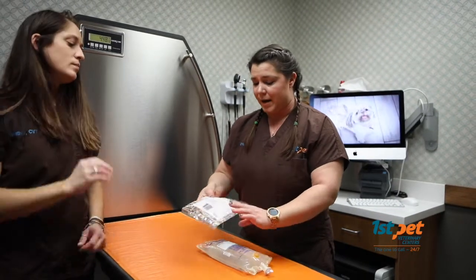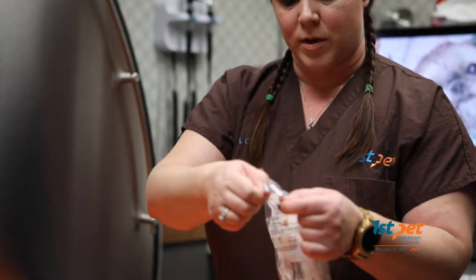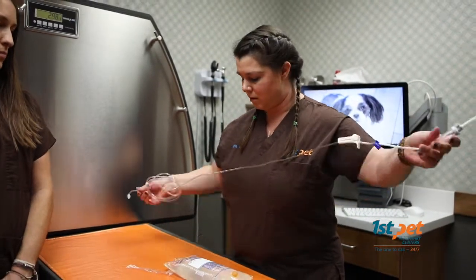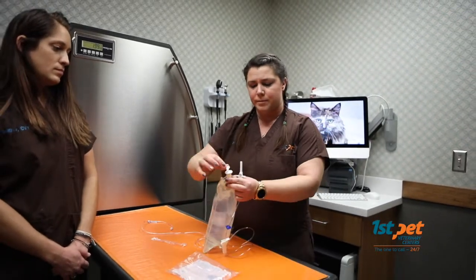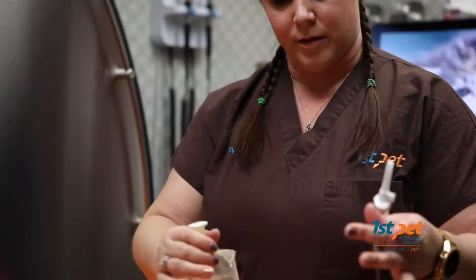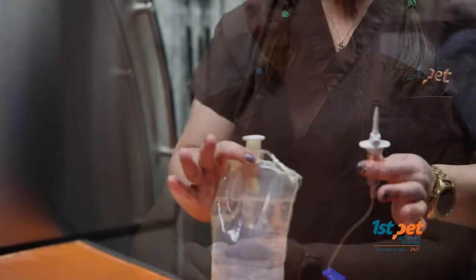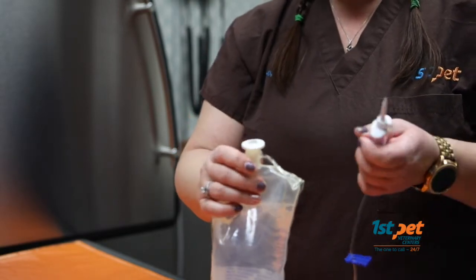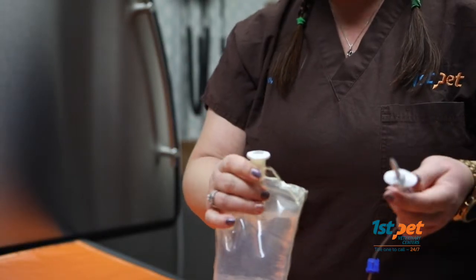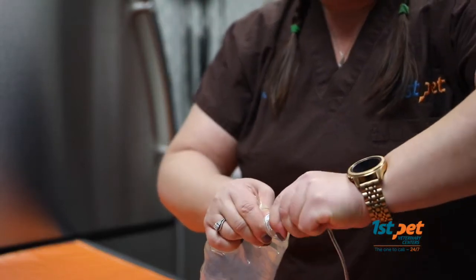When you have to set up a new bag, you'll have a setup that looks similar to this. There's perforated marks on it, so you want to tear that off, and you'll pull your line out. On your fluid bag, you have this nifty little pull handle. Pull that straight out. On your line, you have a little plastic cover here. This also just pulls straight up. One very important thing to always think about when you're doing this is that you don't want to touch the little ports on the fluids, or you don't want to touch this tip once you've removed the plastic pieces. Once you've done that, you want to stick this end straight in.